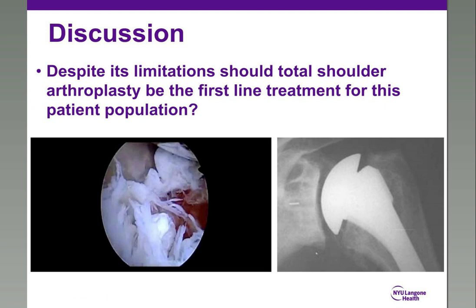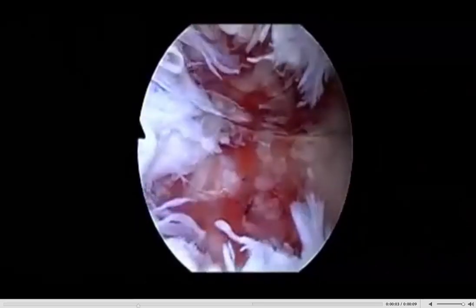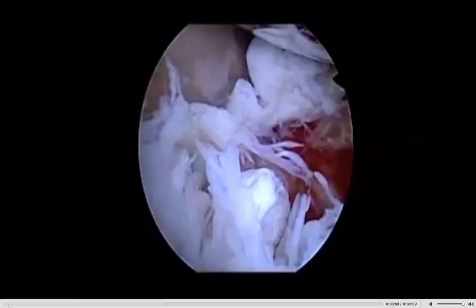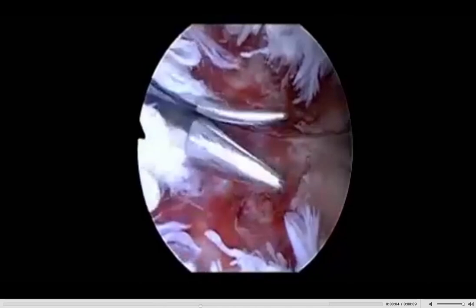I'm going to ask Tyler to show you all the video here on the left, which shows an arthroscopic view of a failed biologic resurfacing using a lateral meniscus allograft transplantation. You can see the hemiarthroplasty at the top, and you can see that the lateral meniscus allograft has truly disintegrated and looks quite terrible, with eburnated glenoid bone present at the base and very frayed remnant lateral meniscus allograft tissue. So this is truly a failure, and as we showed, it can impact the outcome of a future arthroplasty utilized as a conversion.